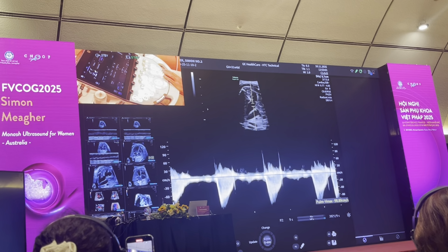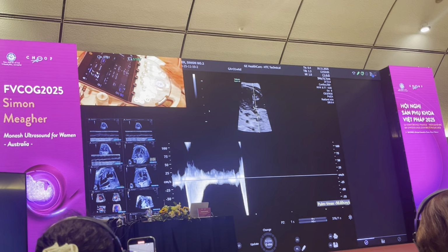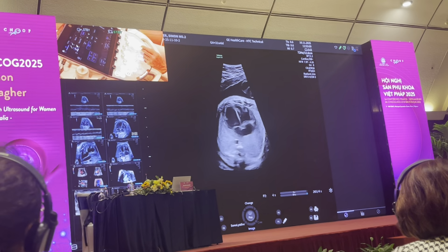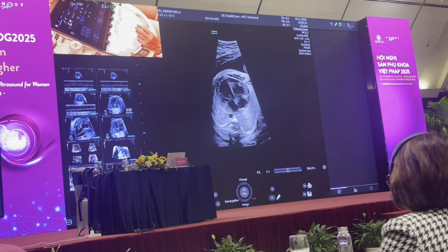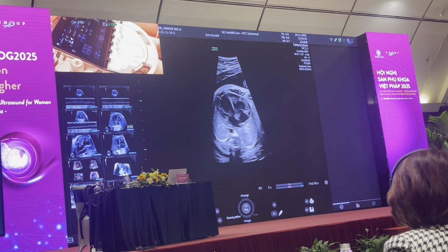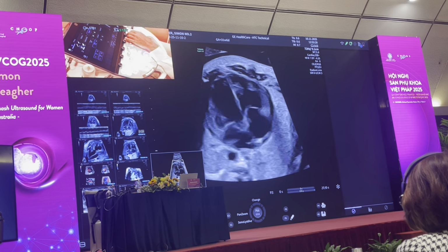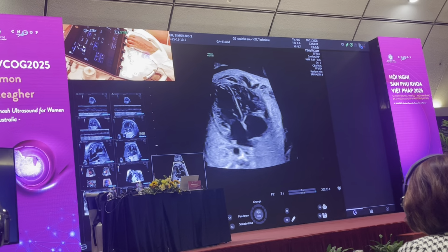So similarly, the velocities, when I compare one to the other, pulmonary, I go to the aorta. And you can hear the normal velocity, whereas in a baby who's got aortic stenosis, it's obstructed here. You can hear the stenotic velocity in that baby. I think this baby's velocities are at the upper range of normal, but they are normal.